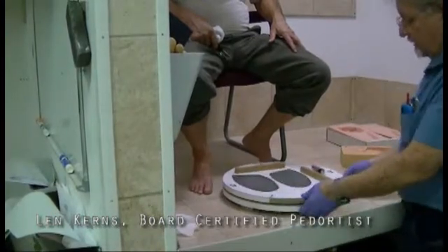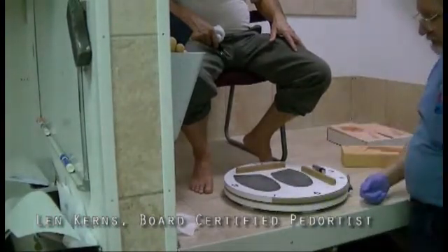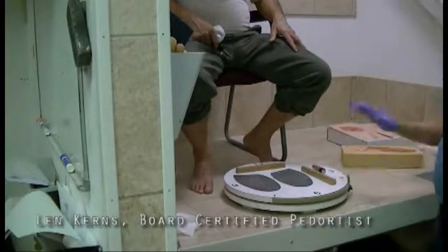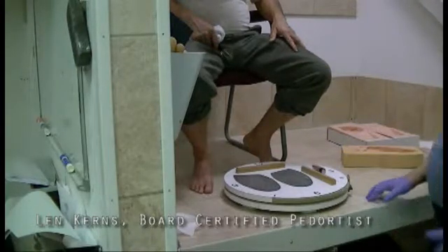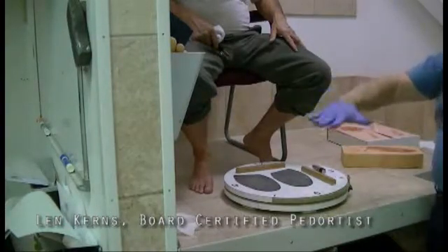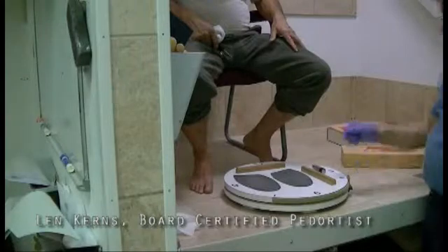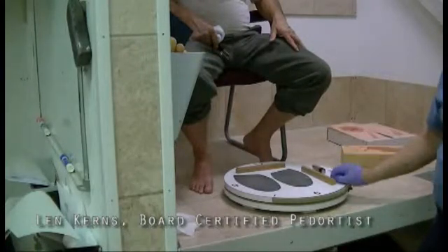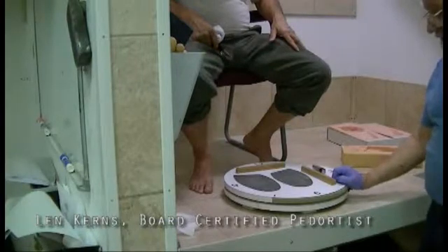So generally at 12 o'clock to 6 o'clock you set it in front of the patient. And for this demonstration I'm using my casting table because it's easier for the camera to see. But this would be on the floor and you'd be on your knees casting the patient. And with this machine it allows you to teach other people in your office to get subtalar neutral.